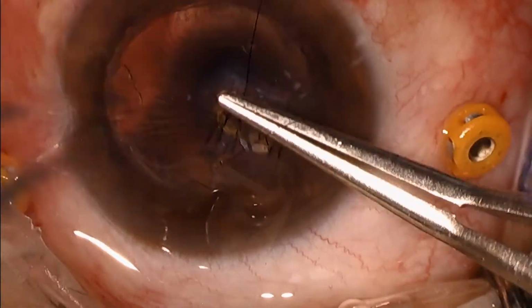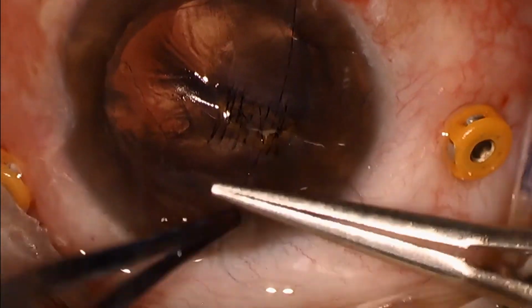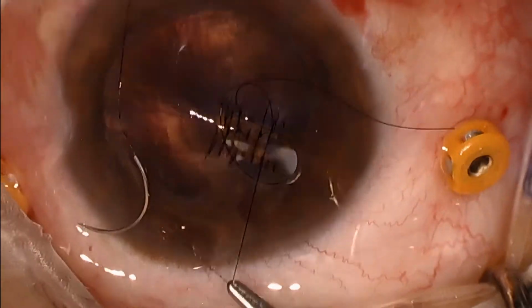So here I'm going to depress the peripheral retina to make sure there's no breaks or tears. So looking at the retina for 360 degrees, we can see thankfully that there is no additional peripheral retinal pathology. I'm going to continue to close this wound a little bit more to see if we can make sure that it's watertight here. And obviously we're creating a whole bunch of astigmatism.